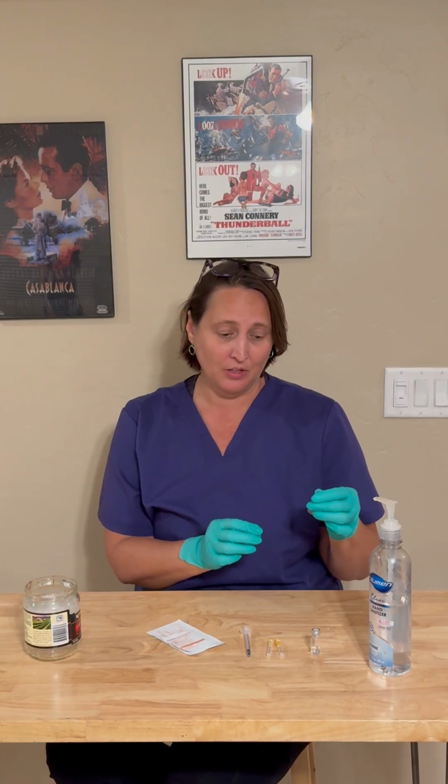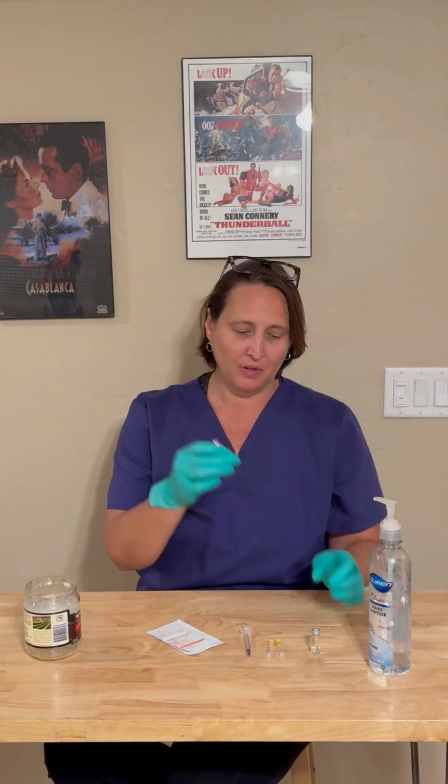The other thing you need to do is verify the expiration and ensure the medication is not expired. You'll look at the liquid in the vial and make sure it's not cloudy, there are no precipitates, and it doesn't look unusual or strange. If there's anything wrong with the vial or the cap has already been removed, do not use it. So you have your medication. I'm going to use a regular needle today because I do not have a blunt tip needle. So I'm going to go ahead and put the needle on my syringe.